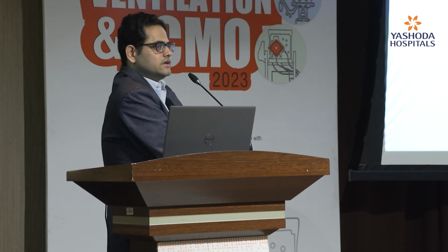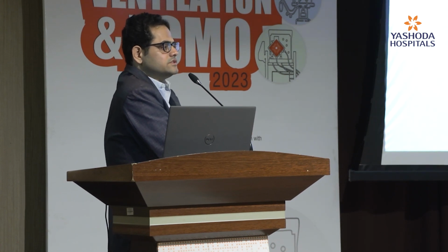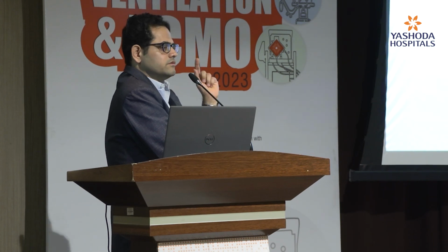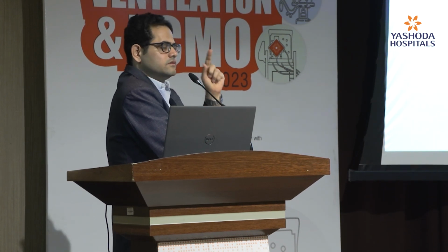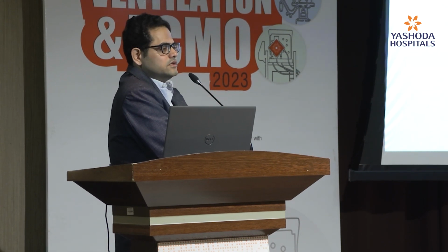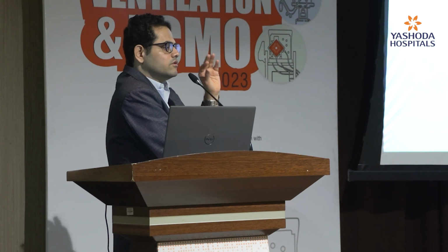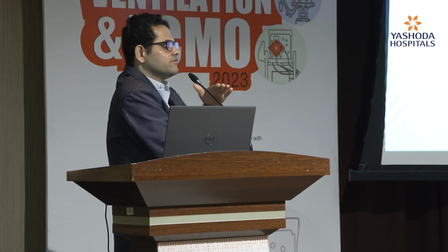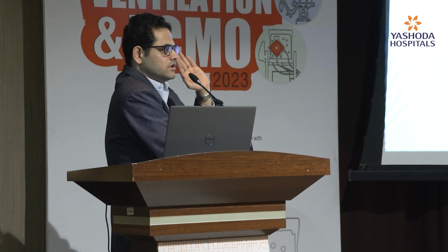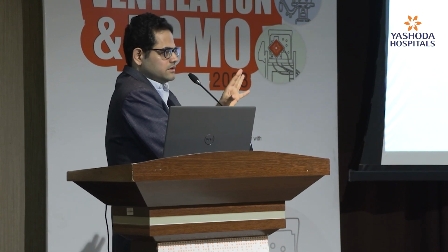So coming to the final point, the take home message of this class: we have to remember the physiology of the ventilator and how the respiratory mechanics works. Flow happens due to the difference between two pressure points. All these scalars and graphs give a lot of information. Always look at what the pressures are, what the volumes are, how much is delivered.